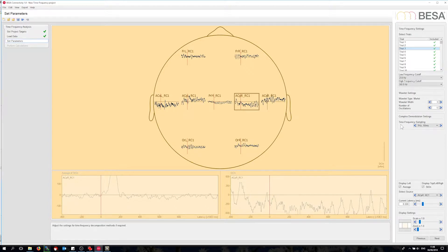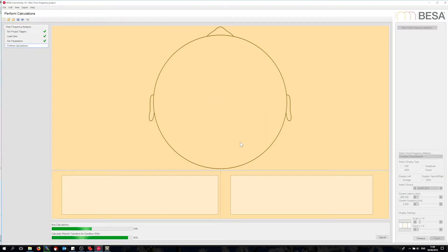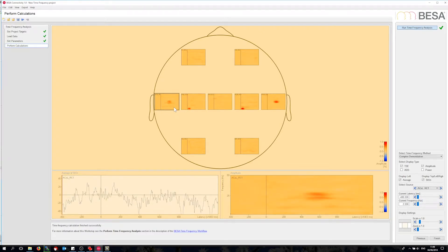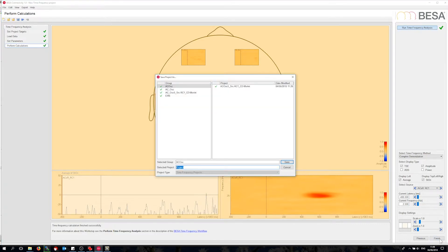Then in the next step I will run the time frequency analysis. This brings up the temporal spectral evolution of the data in the nine source channels that I have in my source montage. The source montage disentangles the brain generators very well. We can see two peaks for the evoked activity and two for the oscillatory activity.